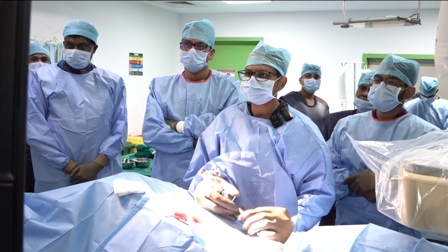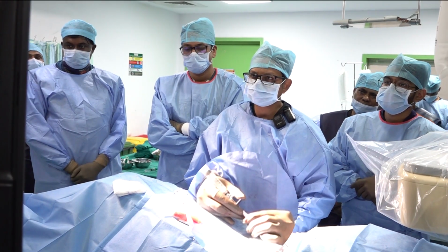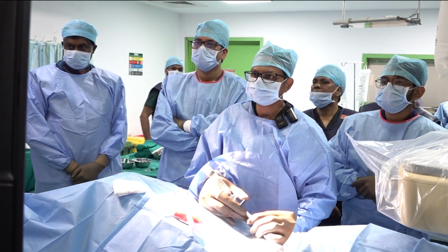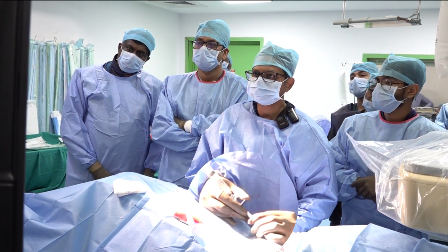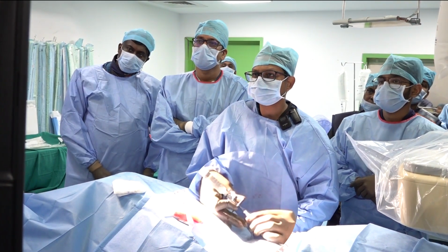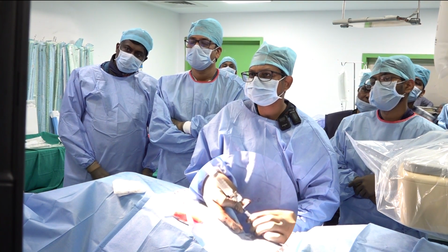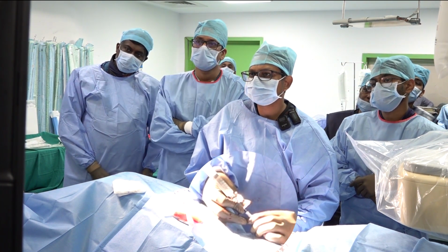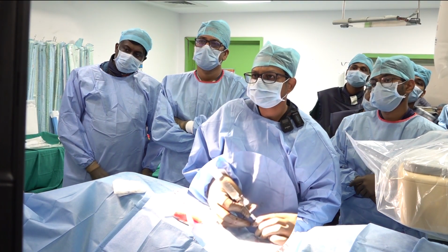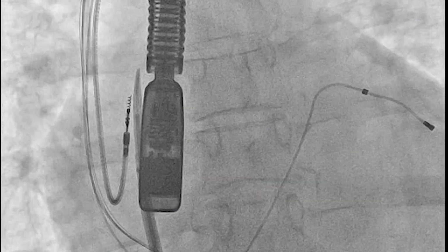Yes, we can go in, sir. Steady push, steady push. It looks like the septum is released. Yeah, there is no tenting, but I'm not so sure whether we are in or not. Now push it in, sir. You are in. Yes, you are in. Yeah, we are in. Push the needle. Push the sheath, sir.